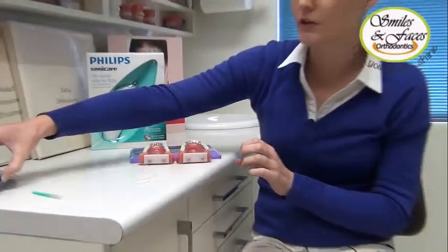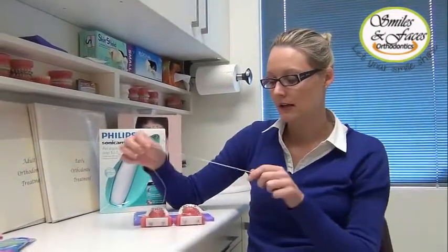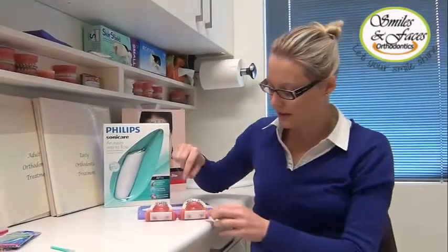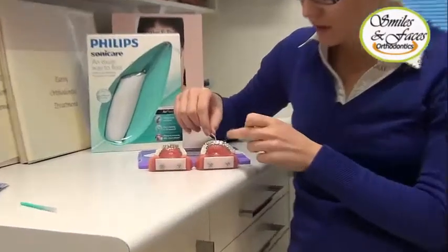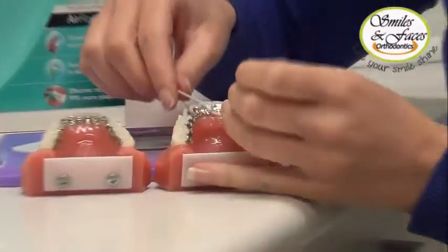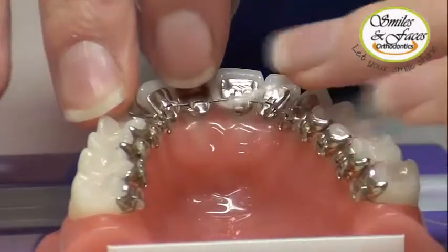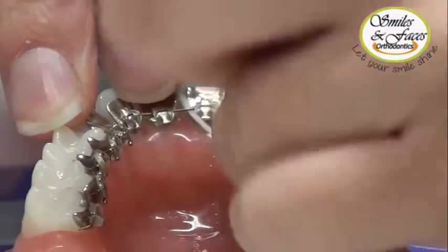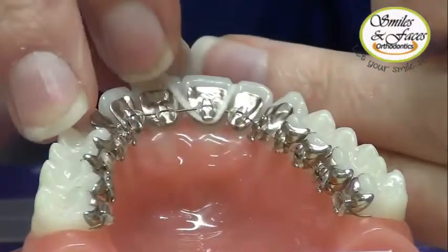Another very useful aid is super floss, which you can also get here. Essentially we put this beneath the wire and use the cotton-like part to go beneath the hook to clean the area. It can be fiddly, but it is effective.